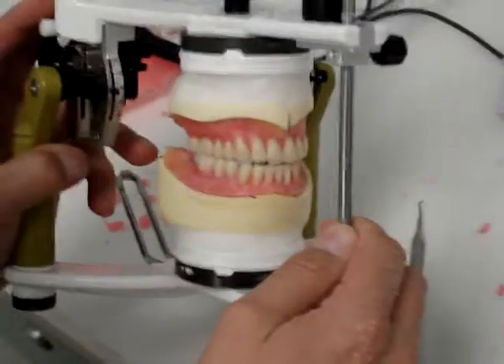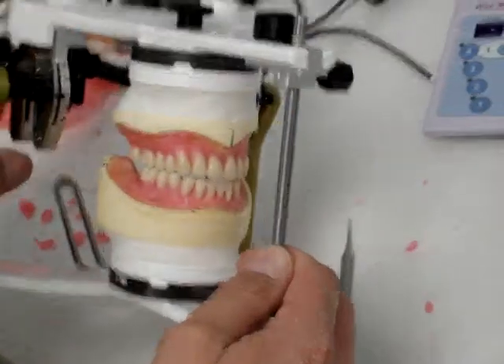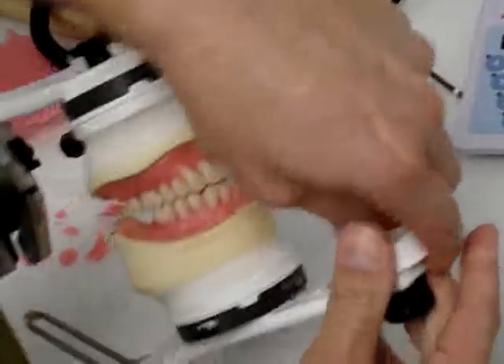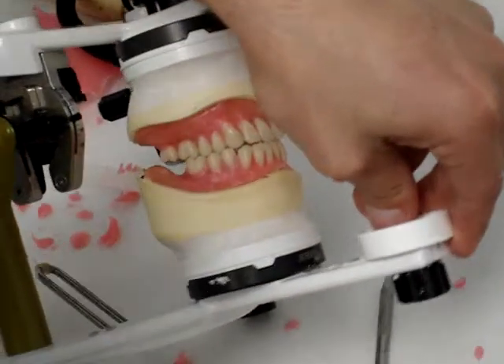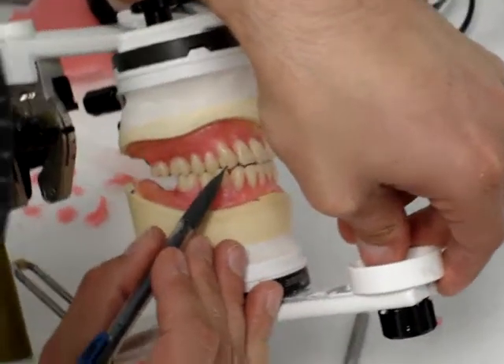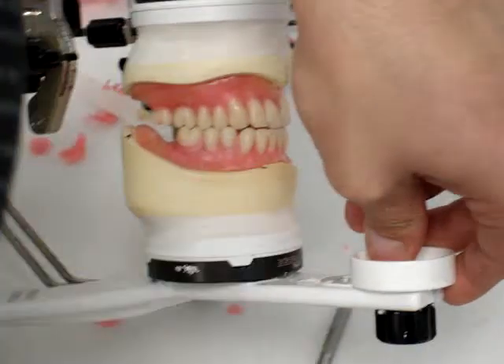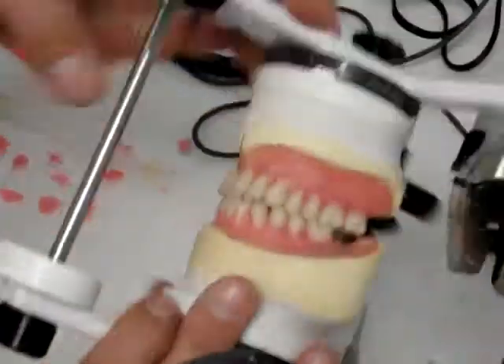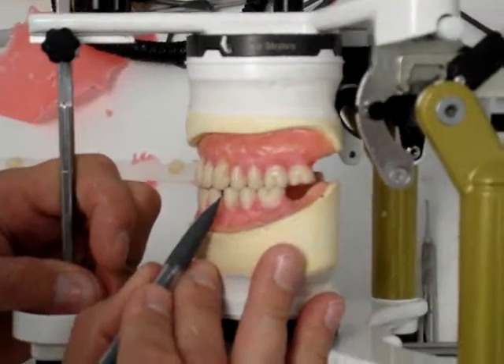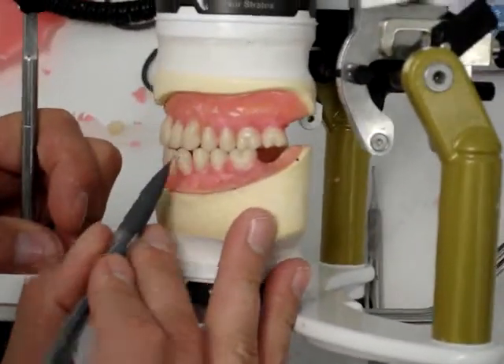As we move the canines down into excursive movements, you'll notice that the premolar and the canine touch, but the canine and canine don't touch. This is one of the easier fixes in excursive movements. The same thing on this side — the premolar and canine touch, but these don't touch.